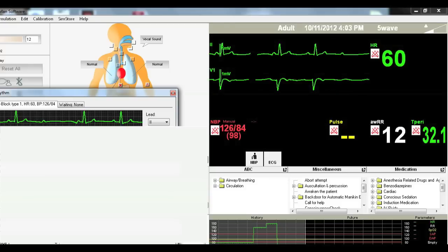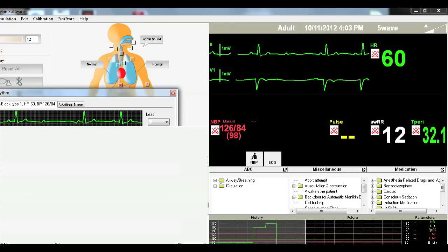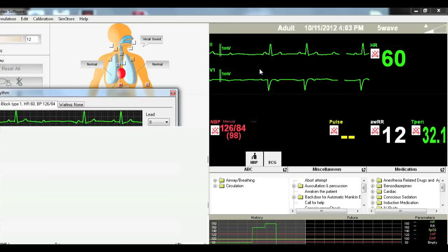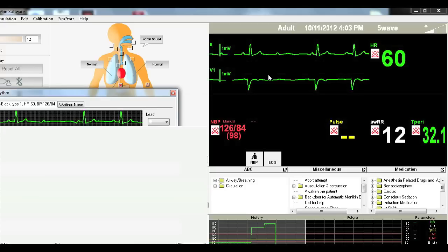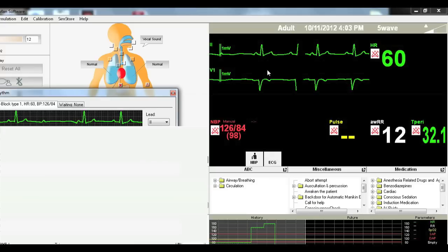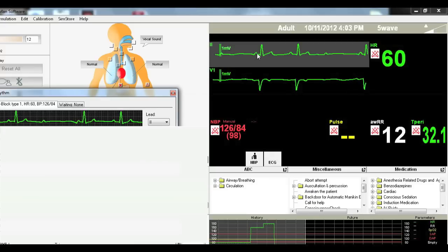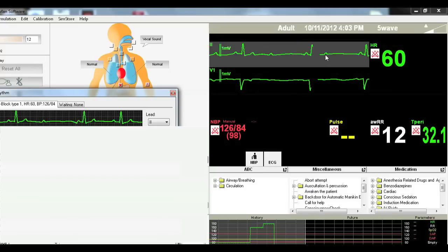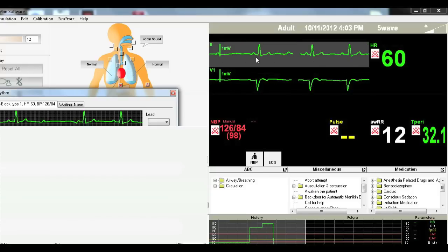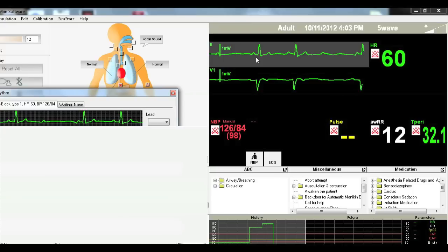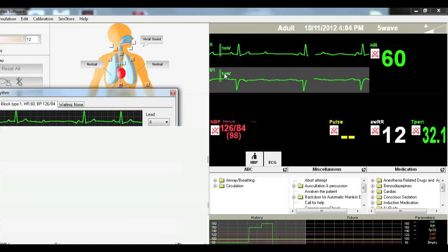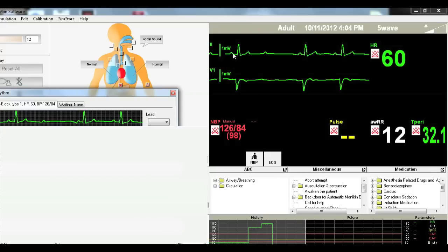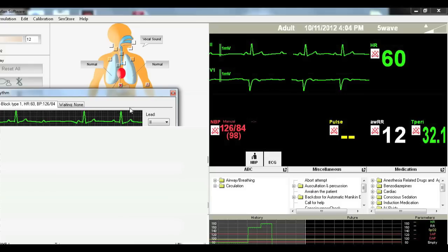So this one is a second degree AV block type 1. So remember in the type 1, our P wave and our QRS complex, so our PR interval gets greater and greater and greater. And then we finally don't even have a QRS complex, right? So here's one P wave, QRS, P wave, QRS, P wave, no QRS complex. So it is pathologic, type 2, or I'm sorry, it's a second degree AV block type 1. Increasing PR interval until you drop your QRS.